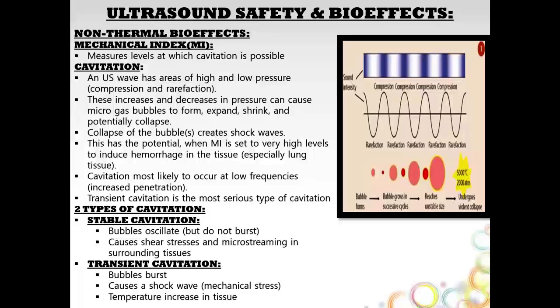And these increases and decreases in pressure can cause micro gas bubbles to form, expand, shrink, and then potentially collapse. And the collapse of these bubbles creates shock waves, and this is known as cavitation. So this has the potential, if MI is set to very high levels, to induce hemorrhage in the tissue, especially in lung tissue in the fetus.